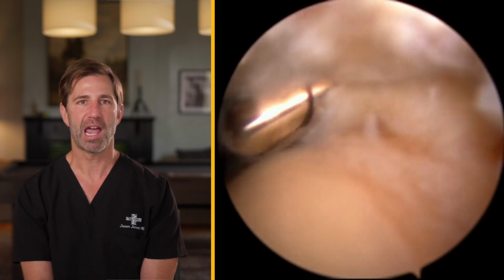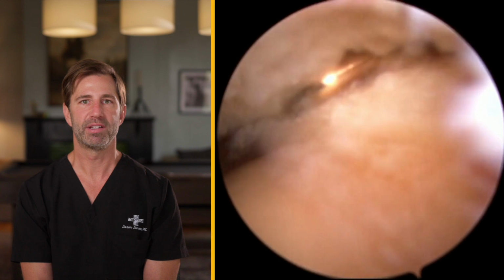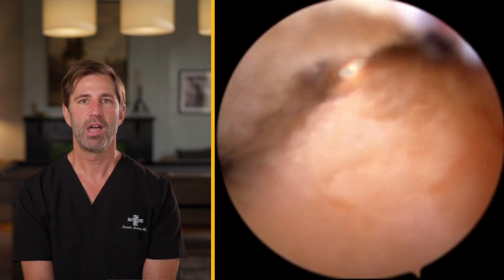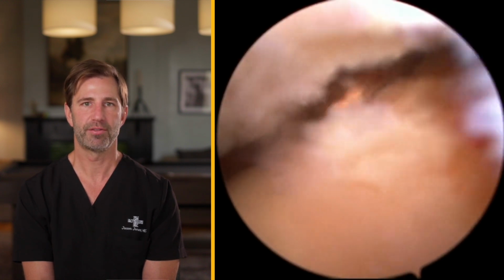Once we've removed the damaged portion and the unhealthy portion of the rotator cuff, we debride the bone itself. This means that we abrade the bone to create bleeding tissue. This will allow for better healing and ingrowth of the new rotator cuff.